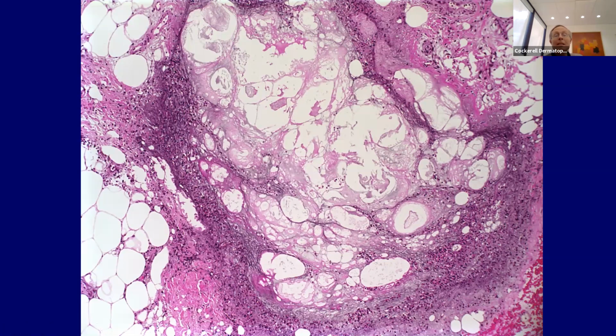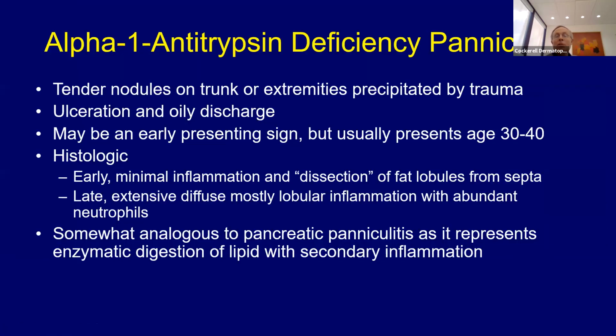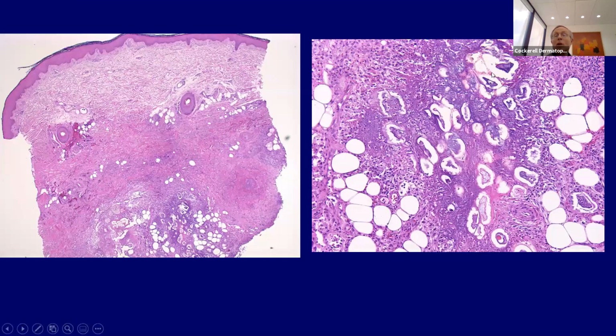It's calcium oleate-like materials that form in the skin. So this is really basically, if you took a biopsy of soap, it sort of would be analogous to this. So this is basically saponification. And here you see one that's got lots of inflammation here. Usually the inflammation is mostly neutrophilic. It really causes an acute inflammatory reaction. So all of these are the residuum of the little ghost-like cells of the saponified fat. And then you see all of this neutrophilic influx here coming in secondarily.